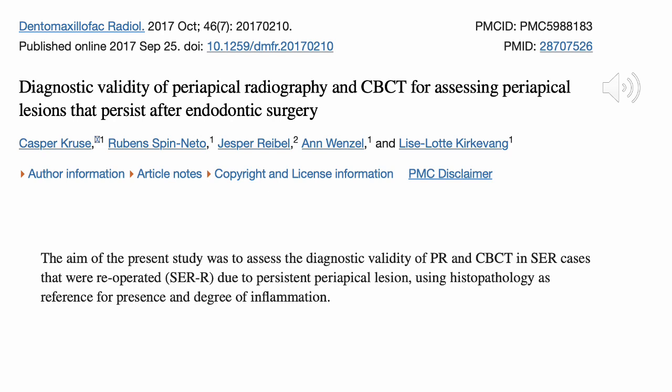Traditionally, healing after endodontic surgery is assessed by periapical radiograph, after Rud and Molven introduced criteria to evaluate the treatment outcome after surgical endodontics. Then, in recent years, the use of CBCT has increased the diagnostic accuracy, especially in the follow-up after surgical endodontics. However, the true nature of inflammation of the radiographic lesion is unknown.